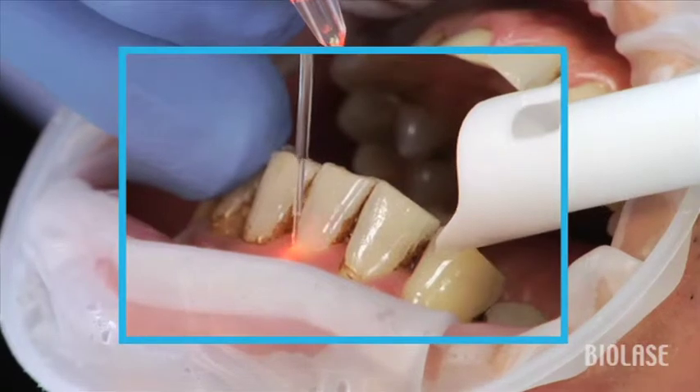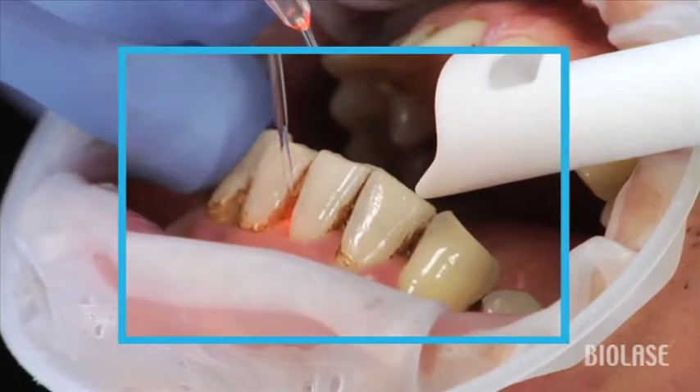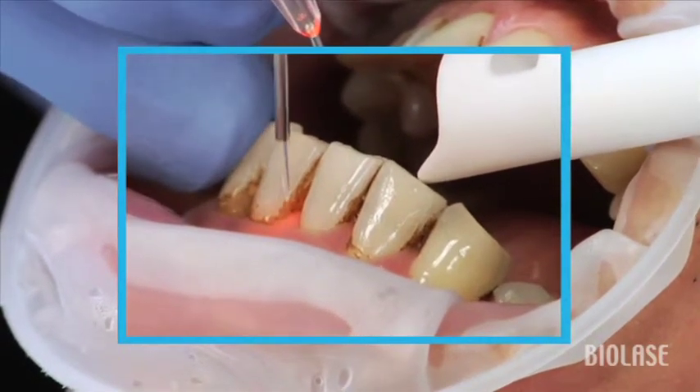In other words, each time you go into the pocket, come out. Go into the pocket and come back out. What you'll notice is that each time you re-enter the pocket, the tip will quench or cool down.